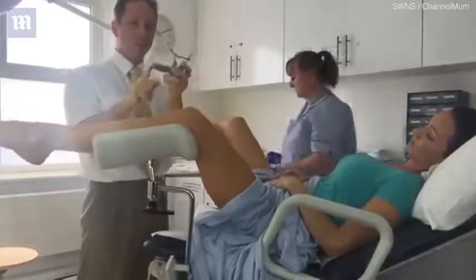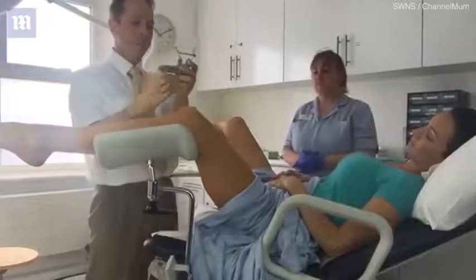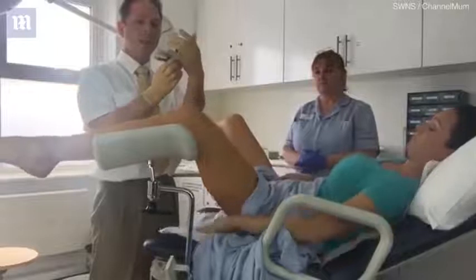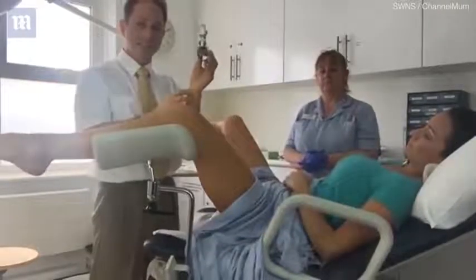We sometimes have plastic ones and other times have metal ones. There's advantages of both, which I won't go into. But in a nutshell, this is placed in the vagina, and we gently open, which allows us to see down the end, and we can see the cervix at the end.